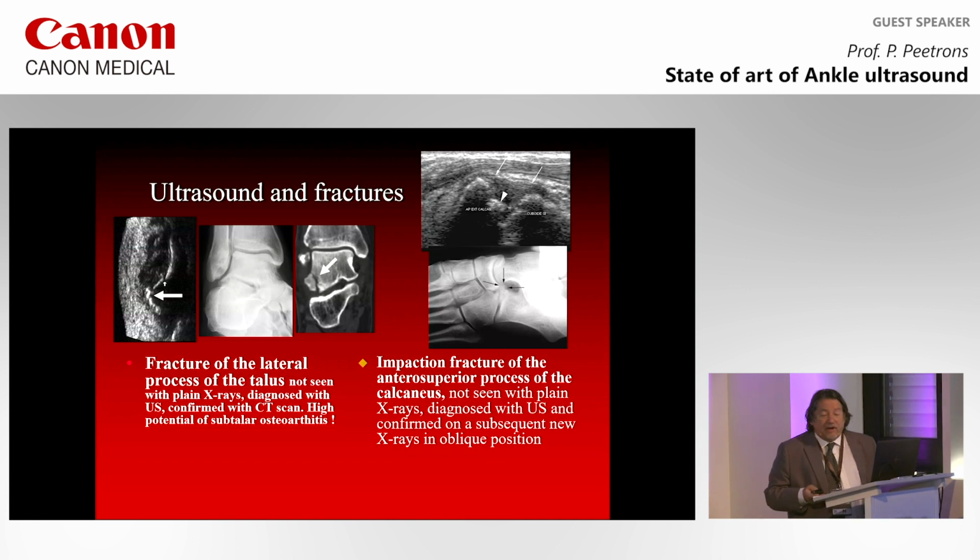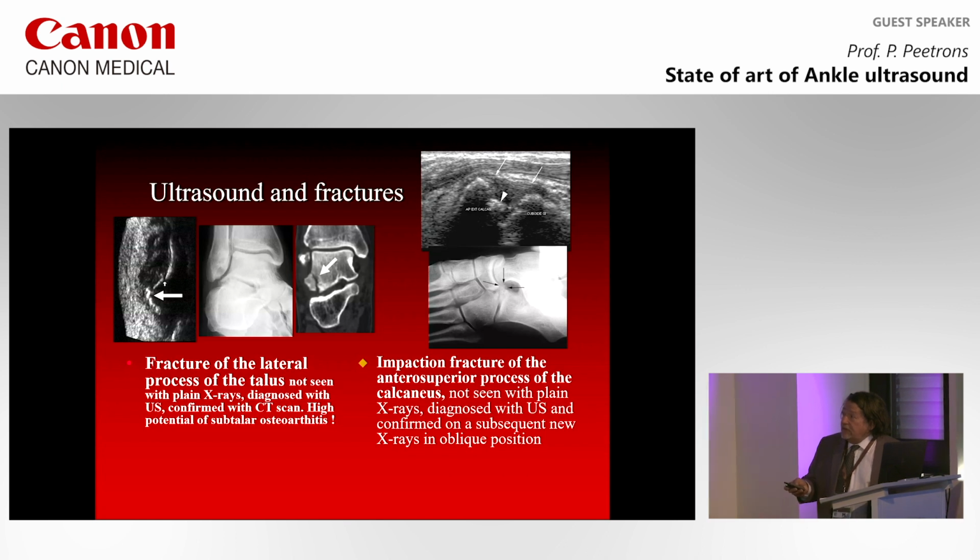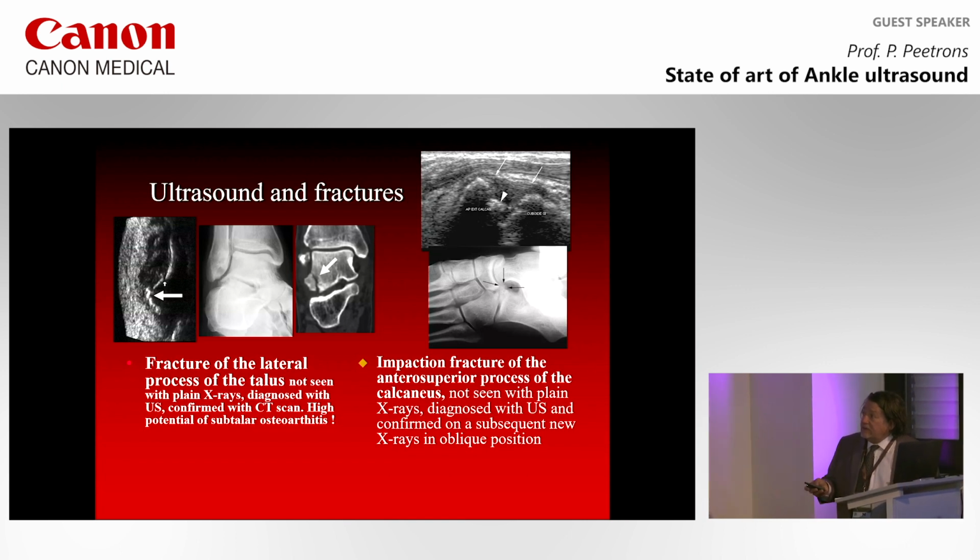So you can see the fracture with ultrasound. You can see without any problem the lateral part of the talus fracture. You see here the little fracture. This is the bony avulsion there. This is very important. It is not very well seen in X-rays. It is very well seen in coronal slices of a CT, and it is also seen with ultrasound.